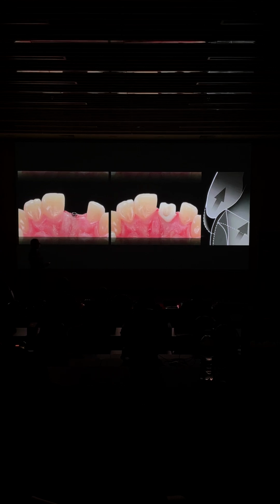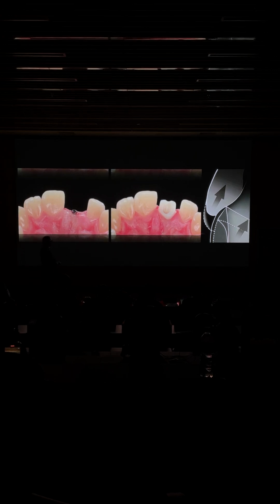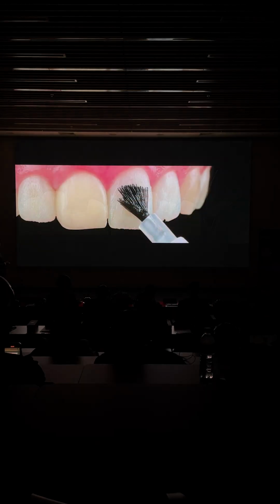At that time, 10 years ago, we didn't have the angulation screws that we have today. So pretty much everything was cement retained rather than screw retained. Today, everything that I do is screw retained, especially because of access to the implant head and the peri-implantitis. So you know that I will explain how we create the emergence, how we modify this tissue as we go along.